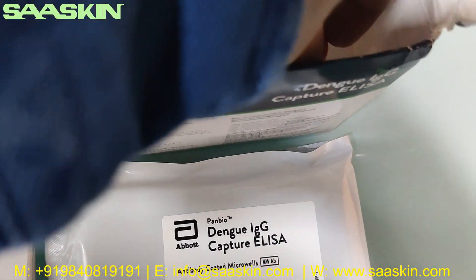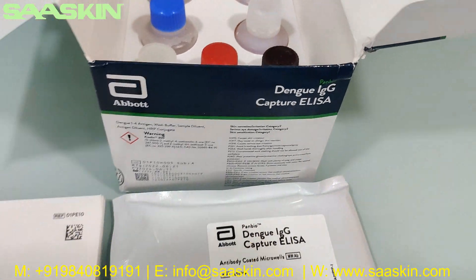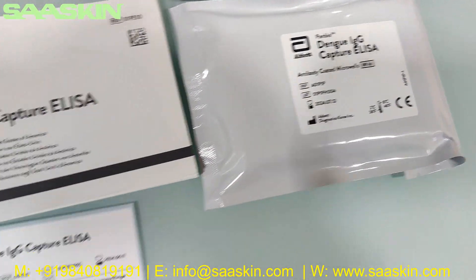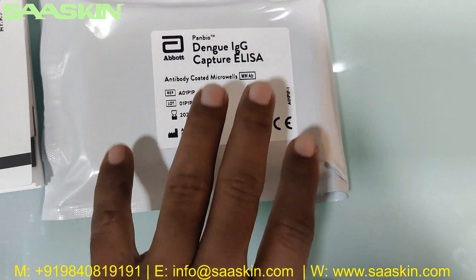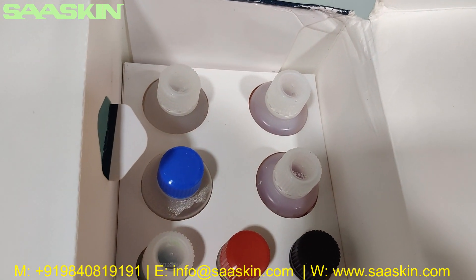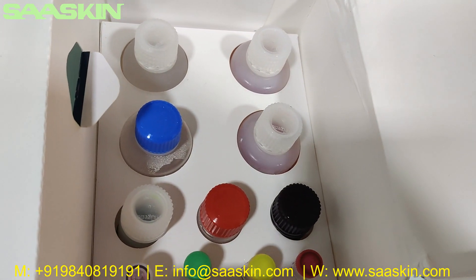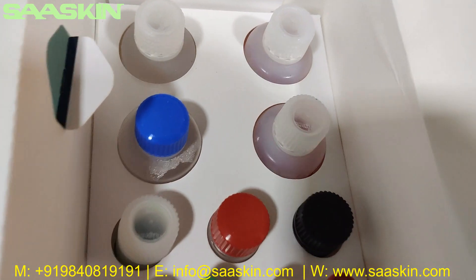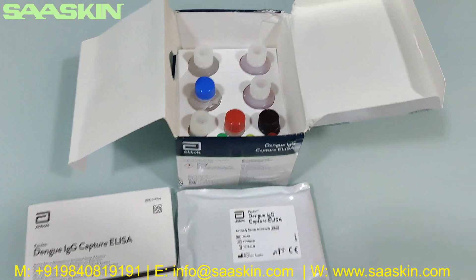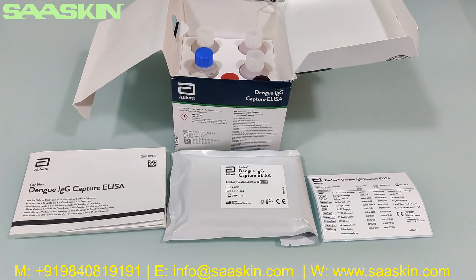So you've now seen all the liquids in this Abbott Dengue IgG Capture ELISA test kit. This is a 96-well kit. There is one manual and one sticker, a Dengue IgG Capture 96-well plate, and all the liquids: antibody-coated microwell plate, Dengue 1-4 antigen, antigen diluent, wash buffer, sample diluent, HRP conjugate, TMB chromogen, reactive control, calibrator, negative control, and stop solution, plus the instructions for use. This is the total kit. Thank you.